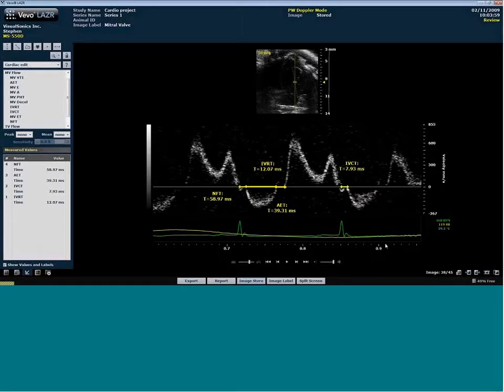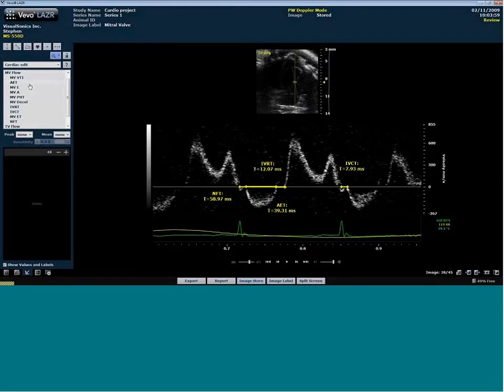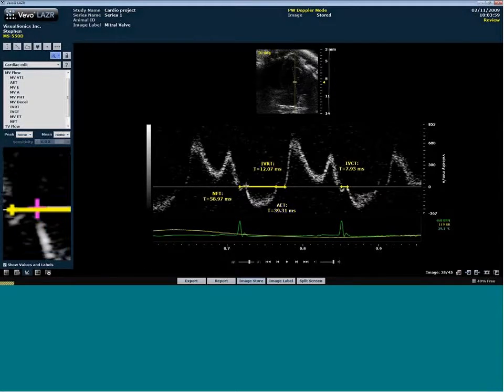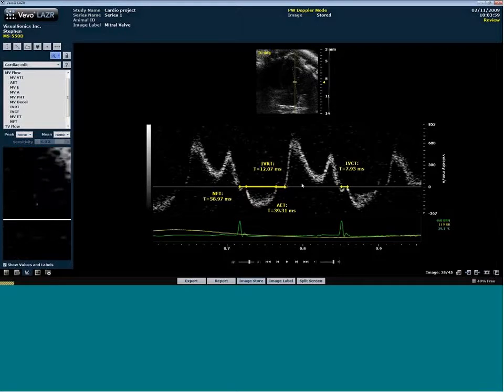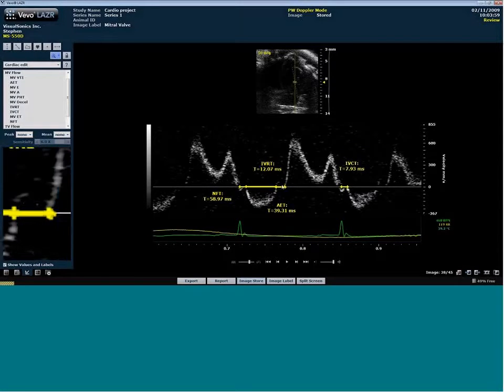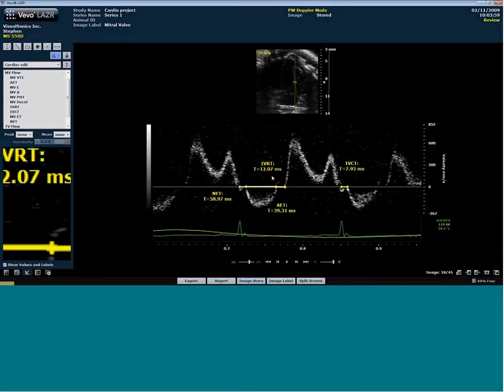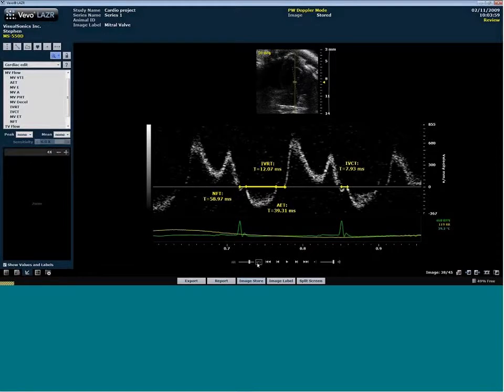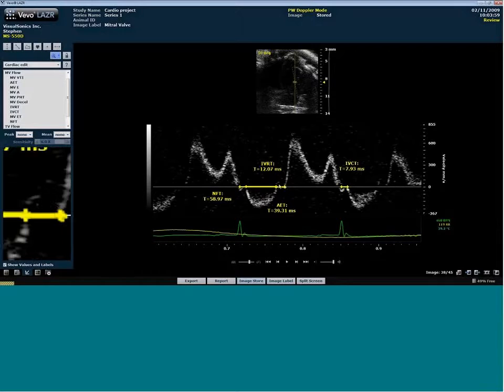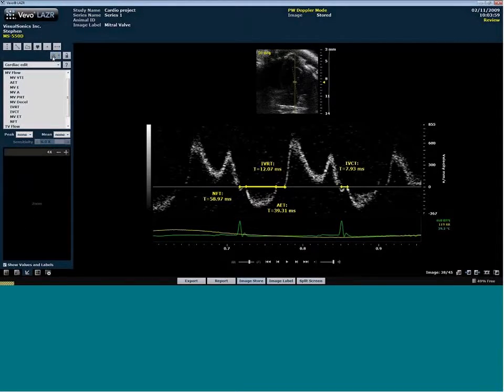When placing those points, use the zoom window on the left side to really hone in on exactly where you want to start and end. Whenever you select a measurement, the zoom window shows up on the left. For measurements like IVCT and IVRT that span very small distances, use a combination of stretching the sweep speed out to make the trace wider and then looking in the zoom window to precisely place those points.